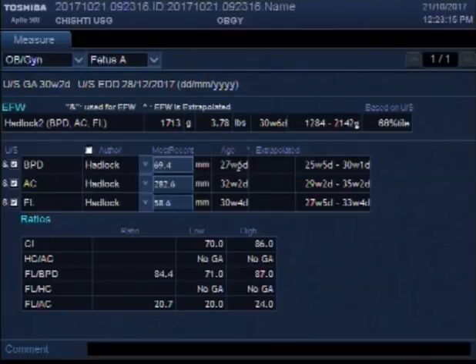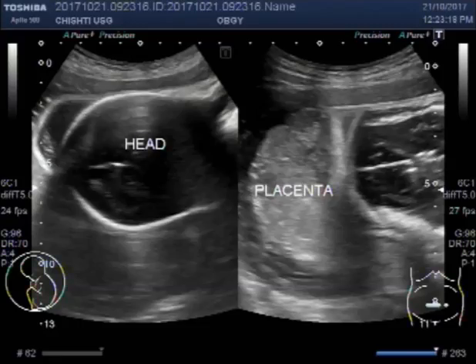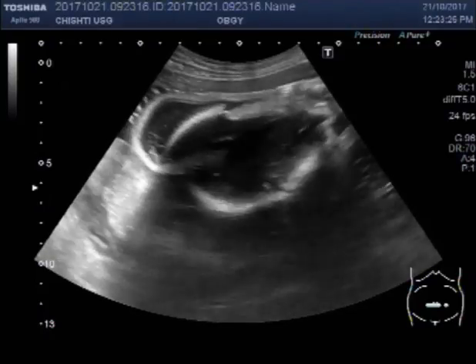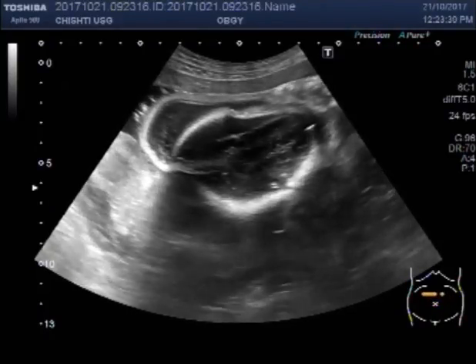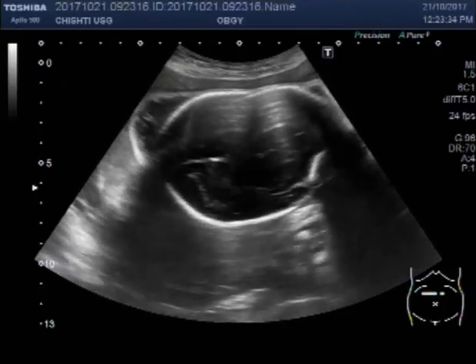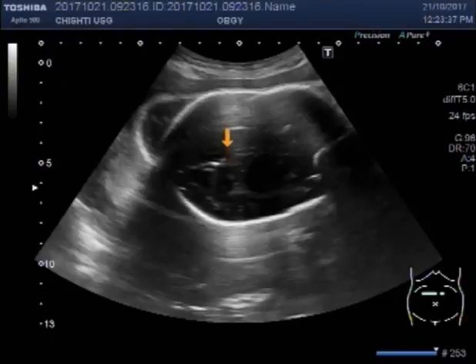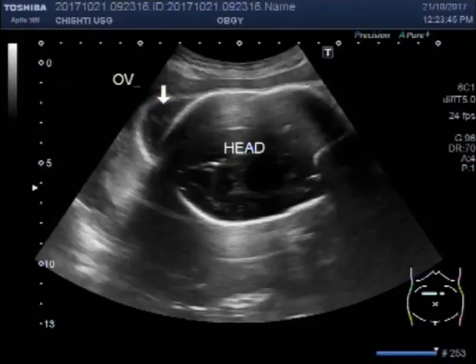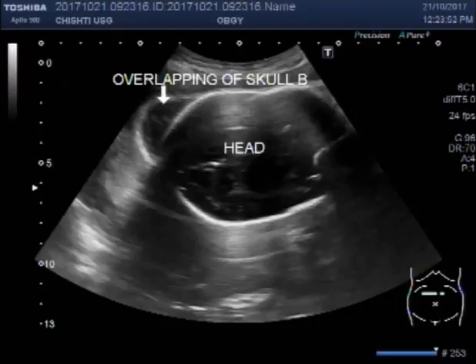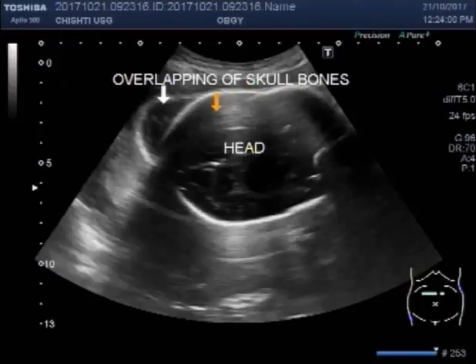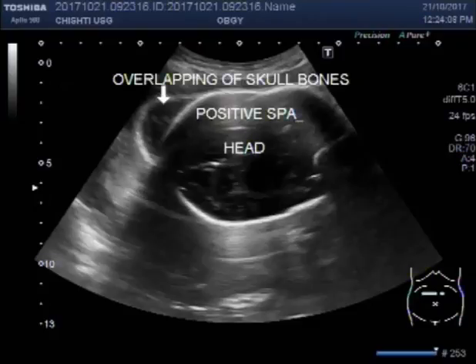Hello viewers, I hope you are fine. This video shows fetal death in the uterus. There is a positive Spalding sign due to the collapse of the fetal skull bones and collapse of the fetal brain. This sign appears usually a week or more after the death of the fetus. You can see the overlapping of the skull bones — overlapping of the skull bones means Spalding sign is positive.